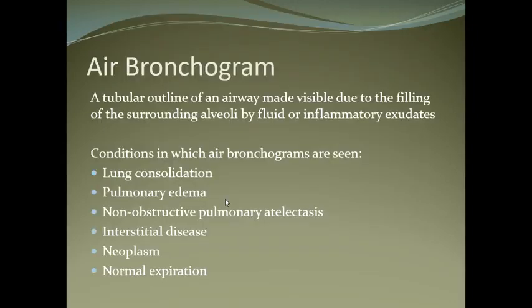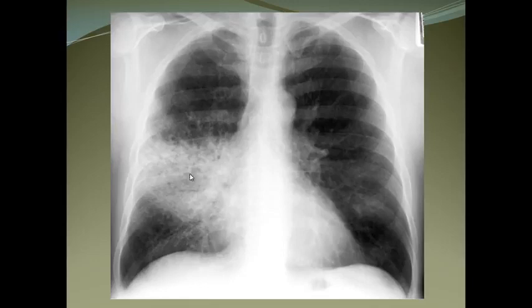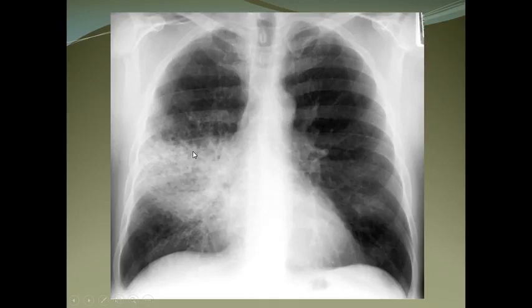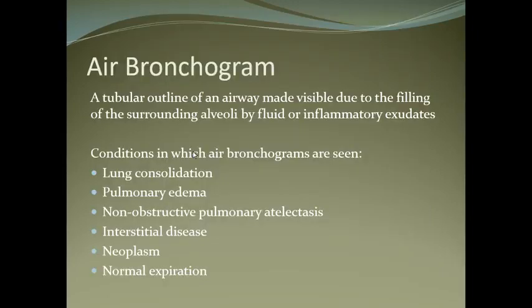Air bronchograms are the linear branching structures seen within a whitish area of consolidation — you can see tiny branching air-filled structures within the white opacity. Air bronchograms are seen in consolidation, pulmonary edema, non-obstructive pulmonary atelectasis, interstitial disease, neoplasm, and normal expiration.